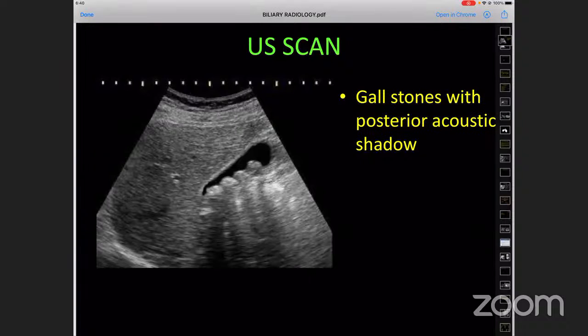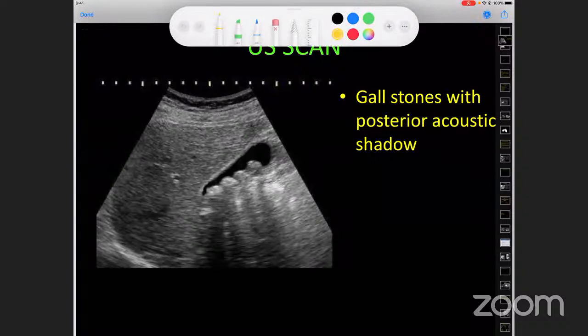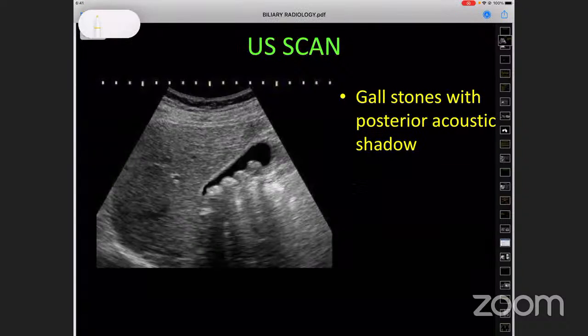What I would like to hear from my radiologist is whether there are any stones. For a start, there have to be stones. One of the problems, and I think Dr. Avik Bhattacharya would tell us about this, is that the ultrasound throws off acoustic shadows behind any echo-opaque structures. Now, the echo-opaque structures can be stones, but they can also be the duodenal cap, you know, the duodenal cap containing air.